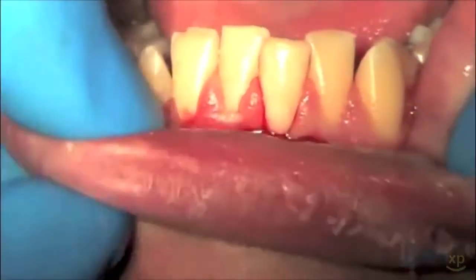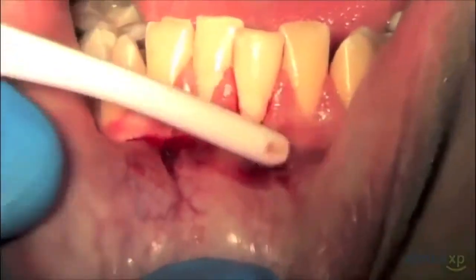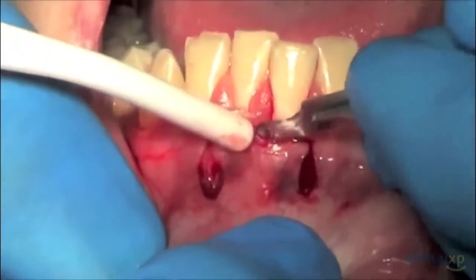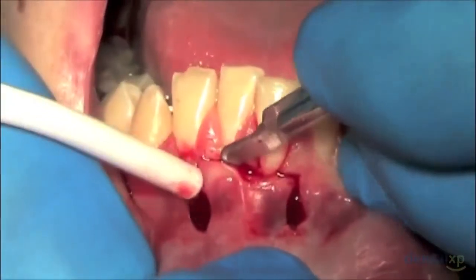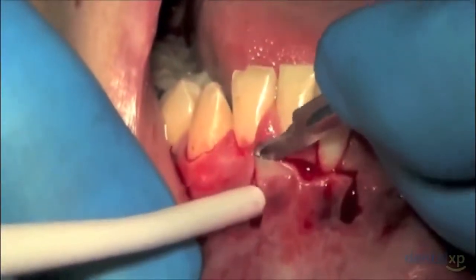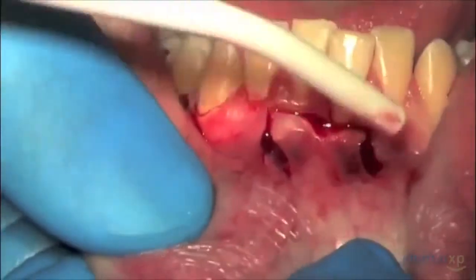With the lower lip retracted, you can actually start to see how strong the frenal pull actually is. At this point, I'll simply freshen up our wound margins to make sure that all of our incisions extend to the bone. And our intent here is to eventually get this very thin, unkeratinized, unattached tissue off of the underlying root surface.